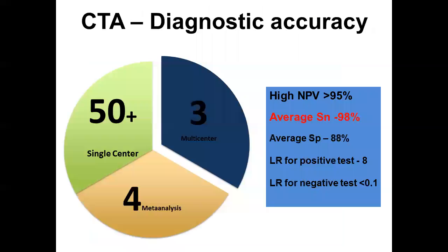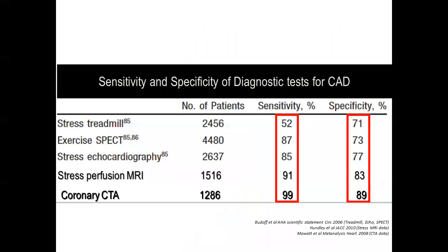Your usual negative predictive value approaches 99% with your sensitivity. So we won't really miss stuff. And here they're quoting a specificity of 88%. I think over time it's gotten lower, as the honeymoon period gets over. Does that make sense with where CT's strong point is?